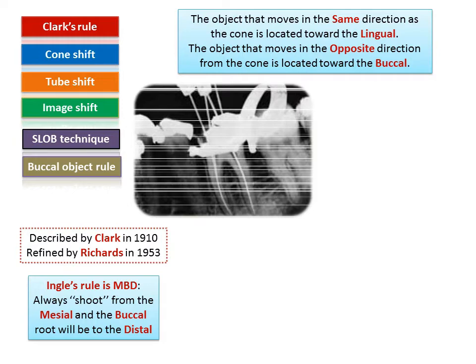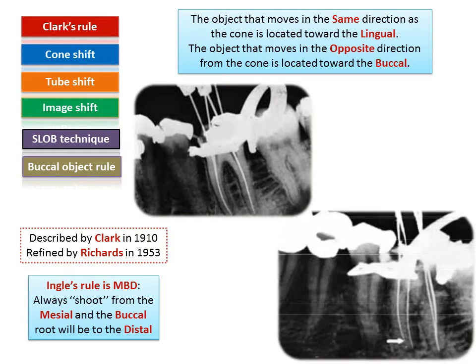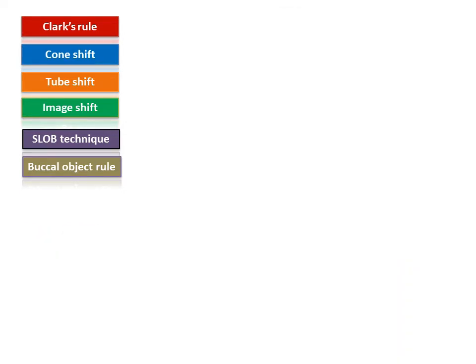In another example of mandibular molars during an endodontic procedure, the first image is a horizontal projection with four files appearing superimposed. In the second image, the horizontal variance has been changed by 30 degrees, and now both roots show two canals each. The first image gives the impression of just one root canal per root, but changing the orientation reveals two canals in each root.